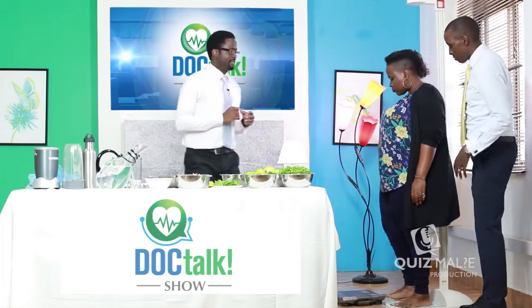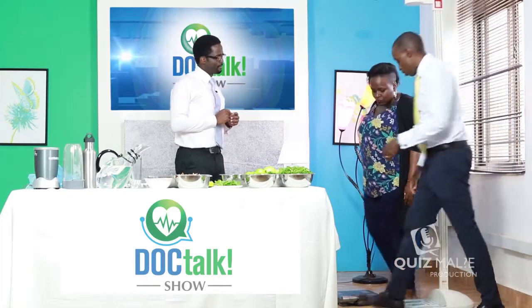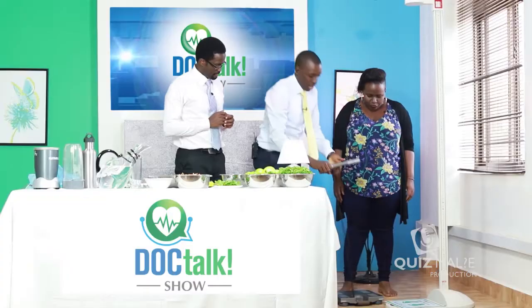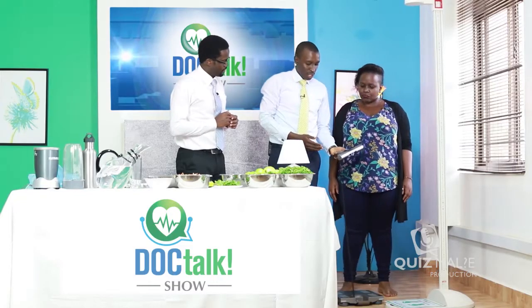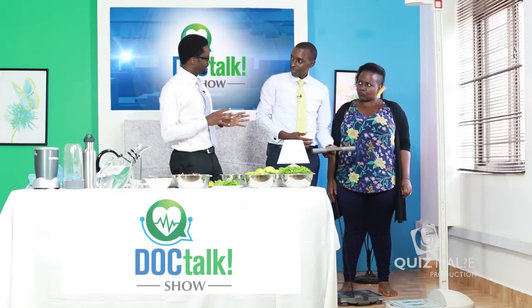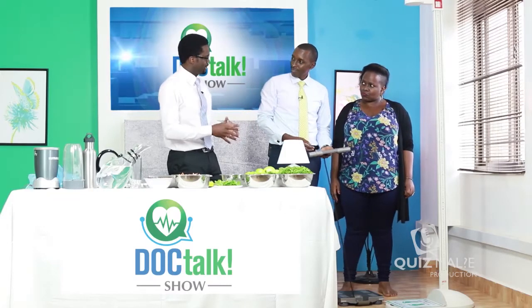Yes, 1.58 meters. And the next thing we are going to do is measure her weight. So this is the body composition scale, and this is what we use to look at your BMI, your body fat, and your muscle percentage. It can measure all that? Yes, it can. It's not just a normal weighing scale.